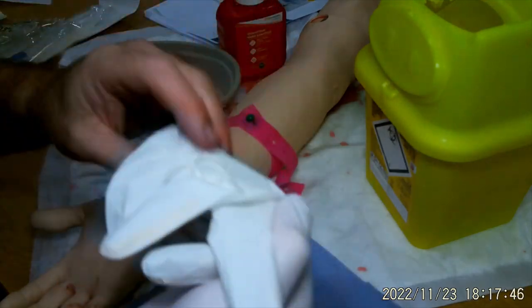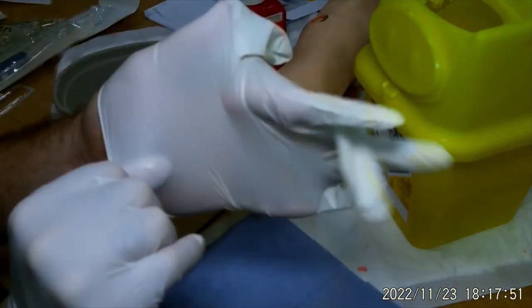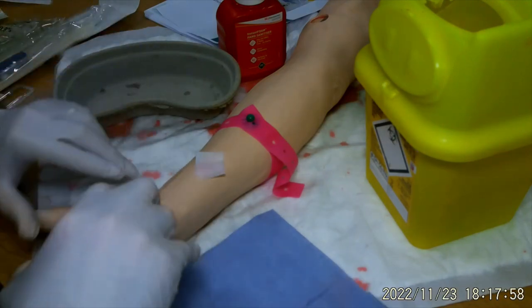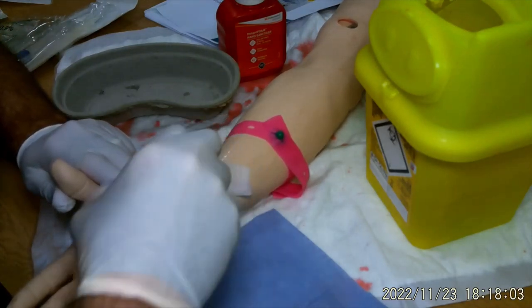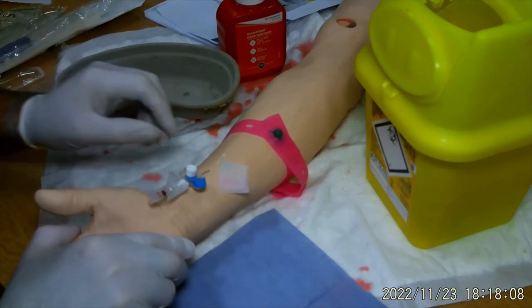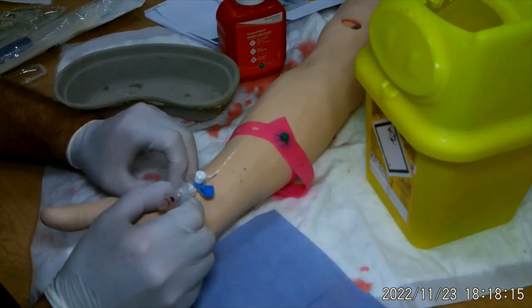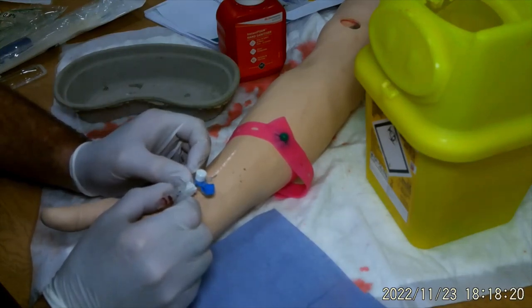So once I've got my gloves on, I don't want that tourniquet on for more than 60 seconds. My cannula is ready to go. This is now dry and I'm going to go straight into that vein there where we looked. We can see we've got our first bit of flashback, which is exactly what we're looking for. Now's the important bit where I hold the actual needle nice and still and I'm going to advance the cannula.